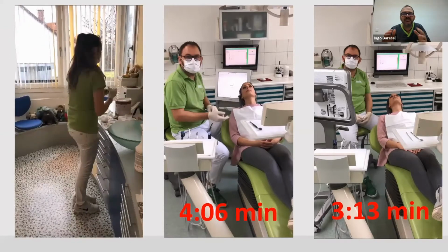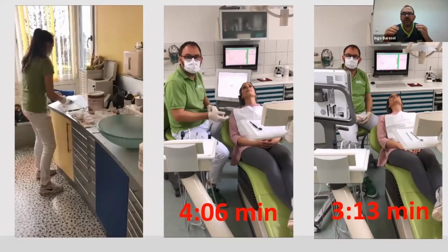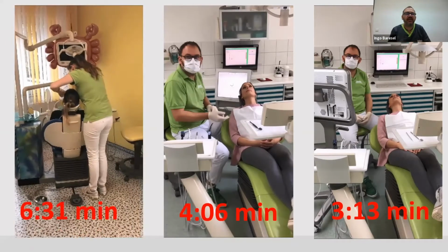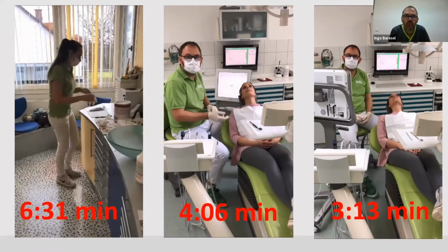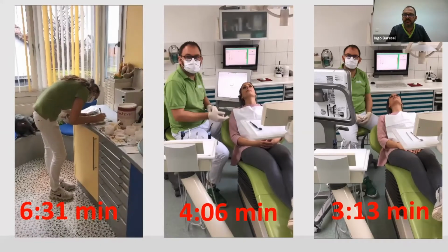The modern scanners are all fast, and they all scan a patient in between 2.5 to 3.5 minutes. She will be ready in 6 minutes and 31 seconds. So I'm nearly twice as fast with scanning than doing analog impressions.